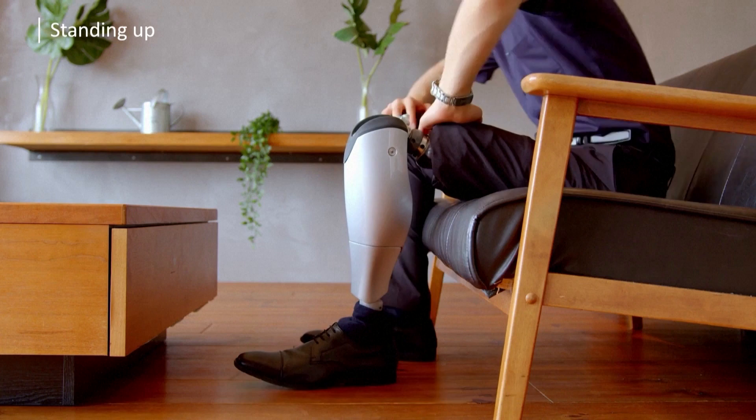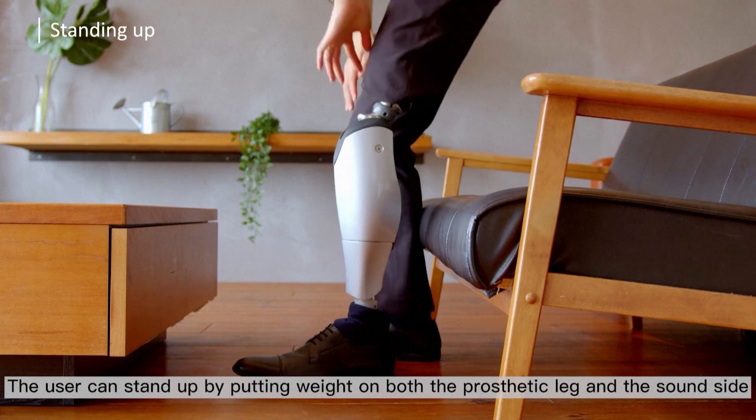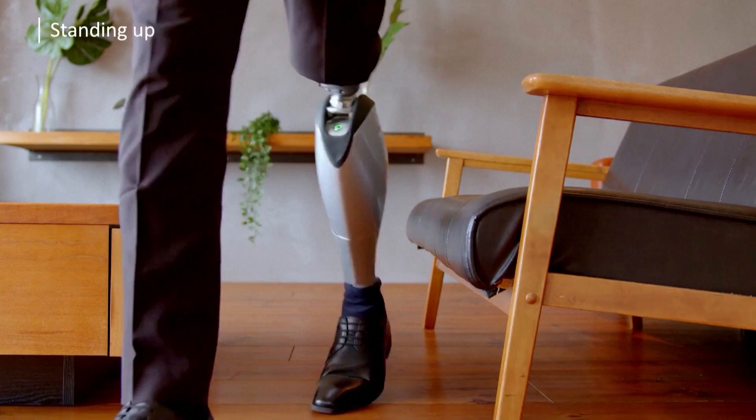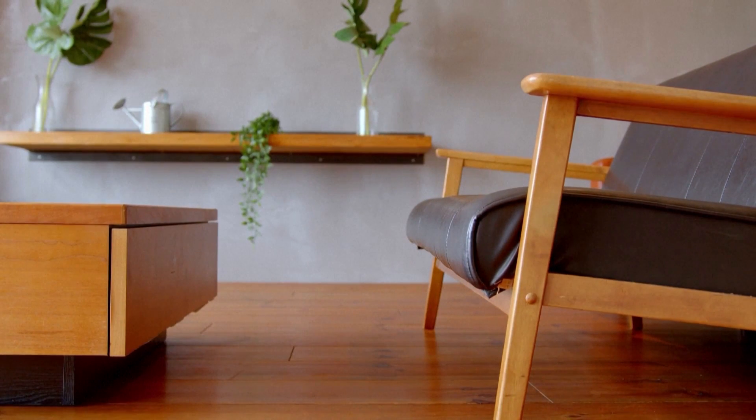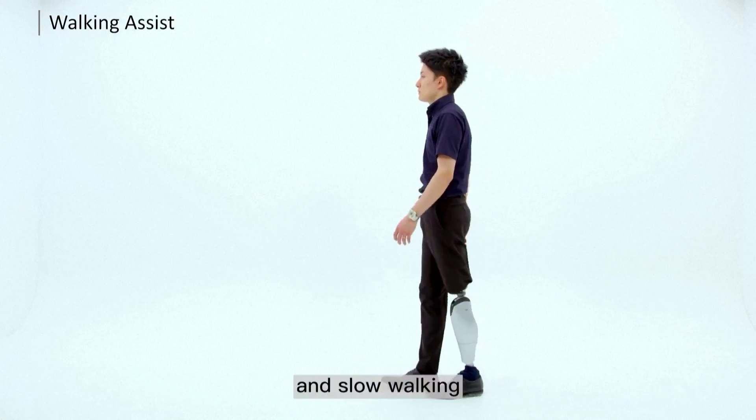When standing up from a chair, the user can stand up by putting weight on both the prosthetic leg and the sound side. It is also equipped with assist functions for fast walking, normal walking, and slow walking.